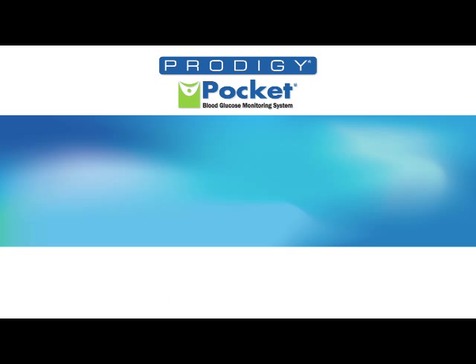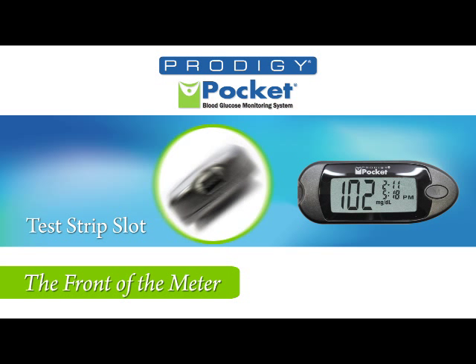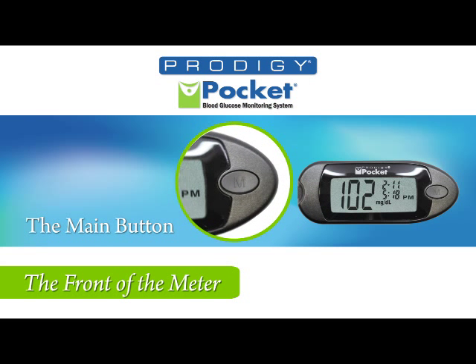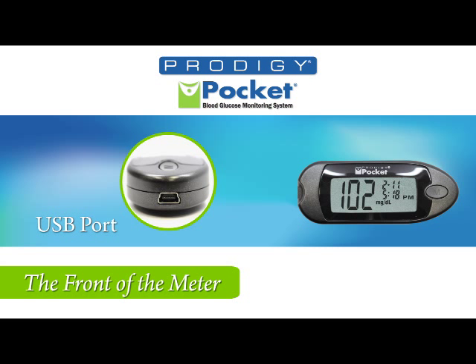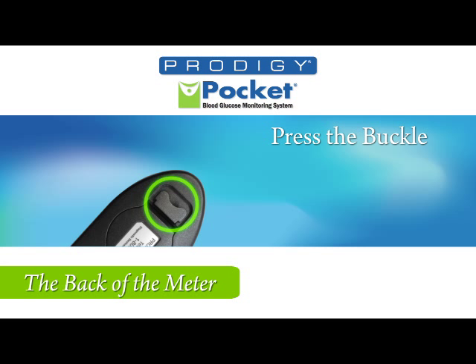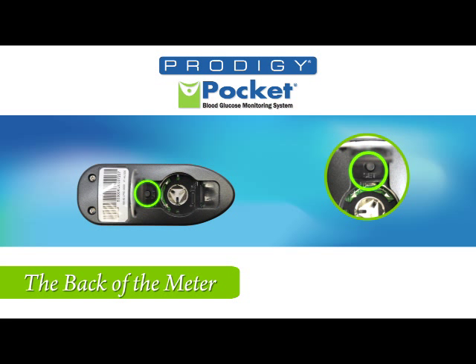Let's take a look at the front of the meter. Starting on the left, you'll see the test strip slot, then the LCD display, followed by the M button. The USB slot is on the far right. On the back, you'll find the buckle, and by pressing down, you'll open the battery compartment and see the set button you'll use for setting the meter.